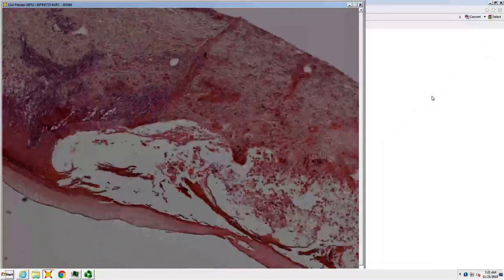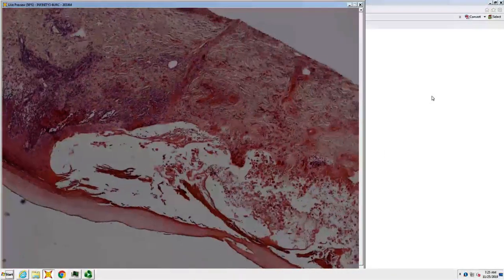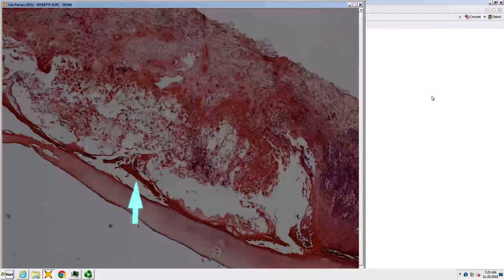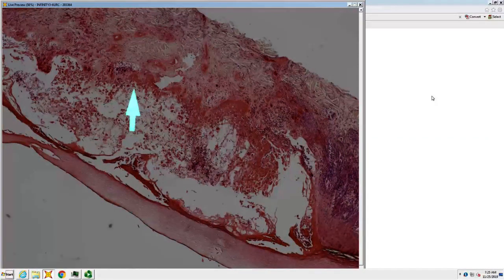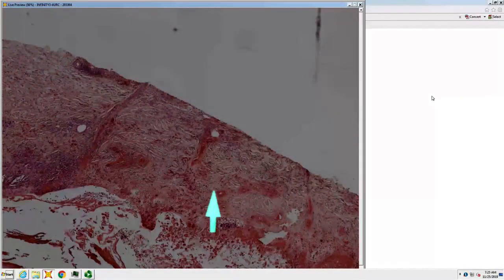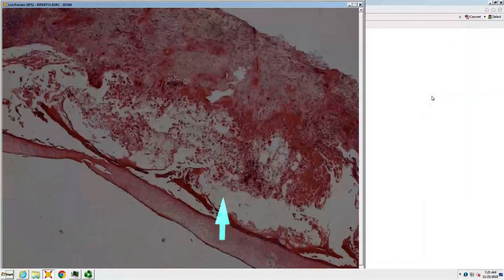So there's a large blister. It looks like acantholysis. Looking for herpetic nuclear changes. Yeah, and you may not see them because all the cells are necrotic, but you see ballooning degeneration, which suggests a herpetic blister. And then what's in the underlying dermis? LCV. LCV, so this is probably zoster. And this would be a typical picture for zoster.